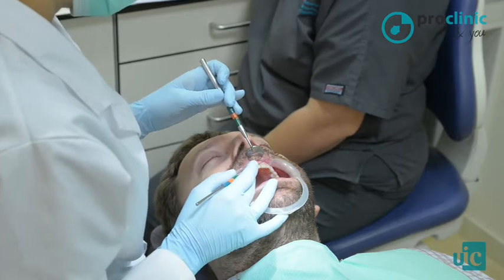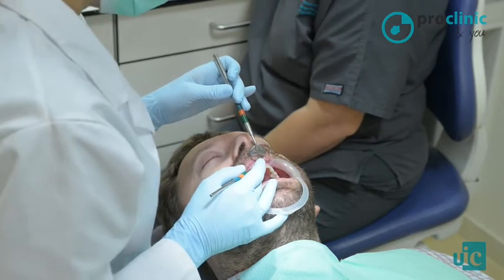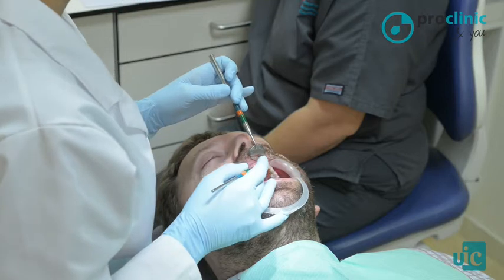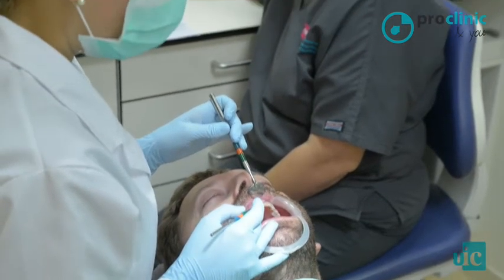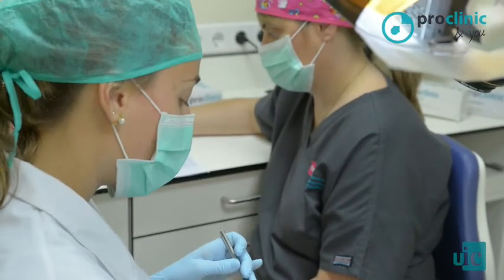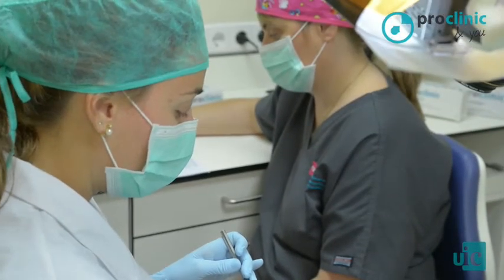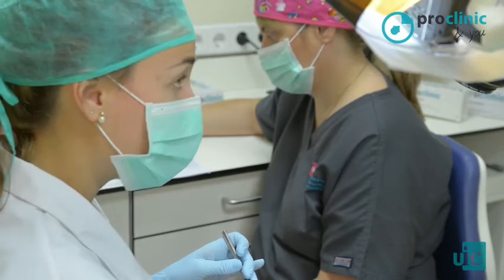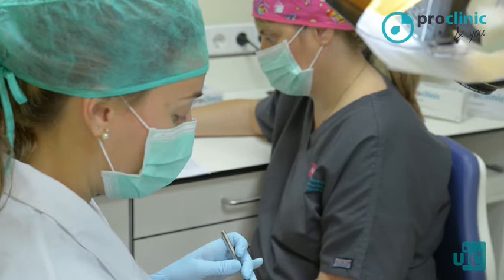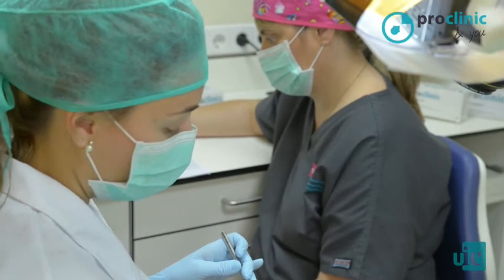During probing depth, we must also determine if there is or not bleeding. If we observe bleeding at probing, we should register in which area it is: mesial, medial or distal, buccal or palatal lingual aspect.